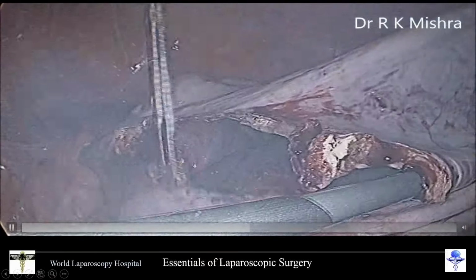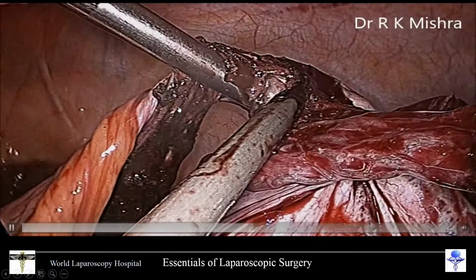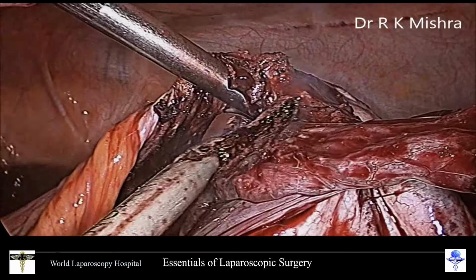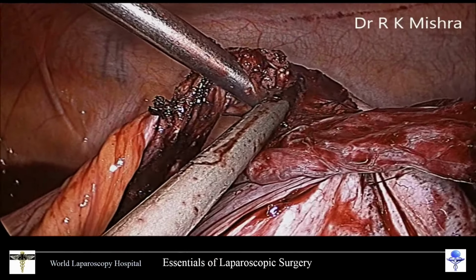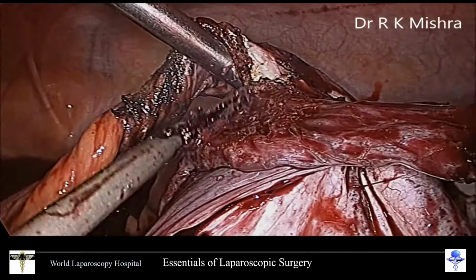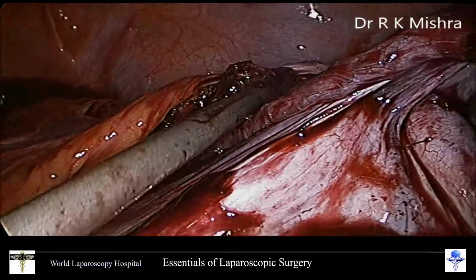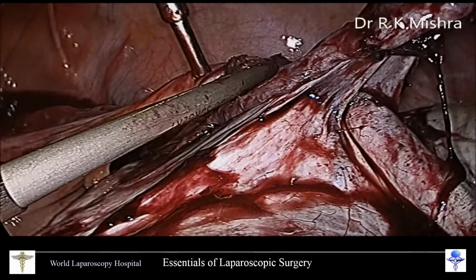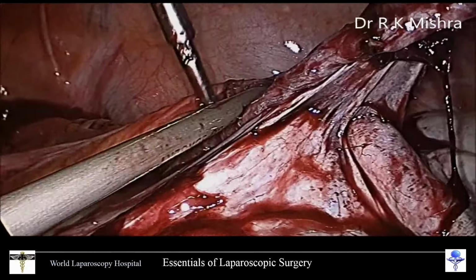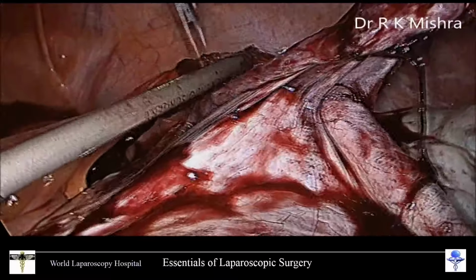And now you will go a little bit more over the infundibulopelvic ligament. Now this is the infundibulopelvic ligament. This is ipsilateral, yes. Actually, the target is, right now we are near the right iliac fossa. The surgery is going on near the right iliac fossa, because in those patients a lot of stretch over the infundibulopelvic ligament is required.